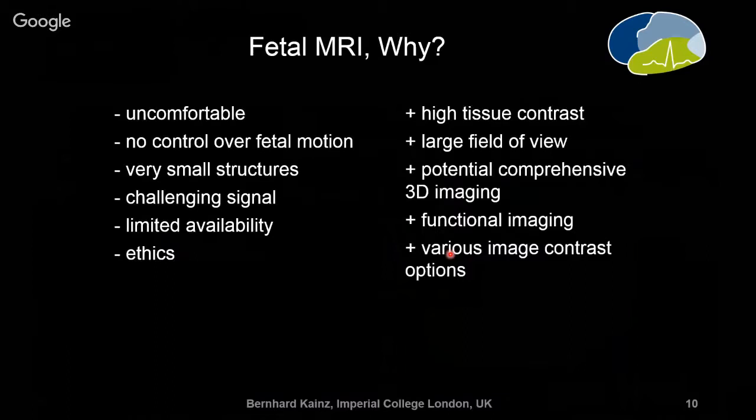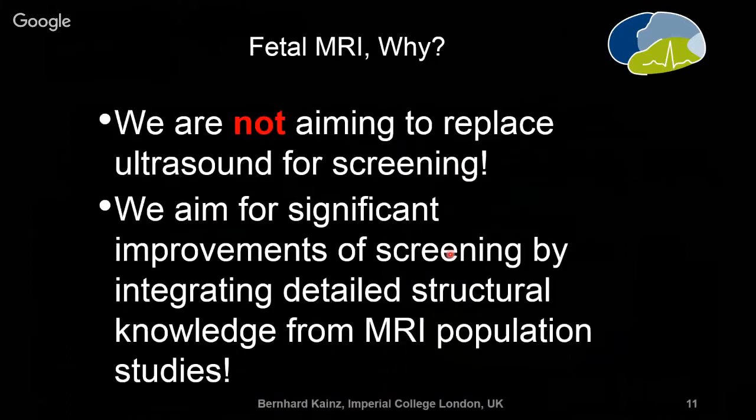To make one thing clear, in our projects we are generally not aiming to replace ultrasound for screening. Ultrasound for screening will very likely be the non plus ultra for the next decades because of its cheap price, availability, and easy application.